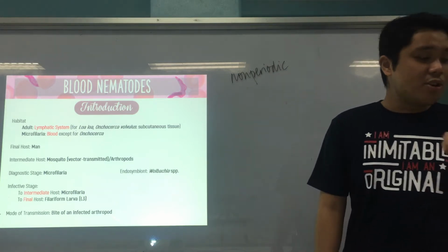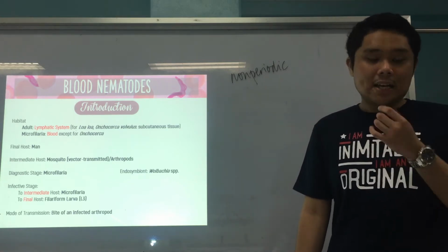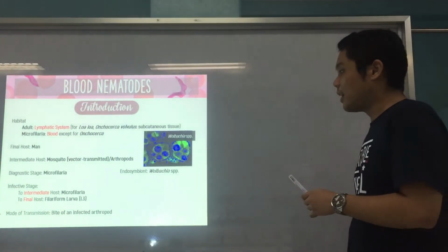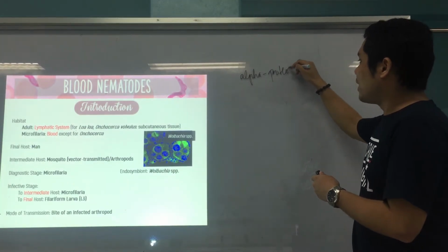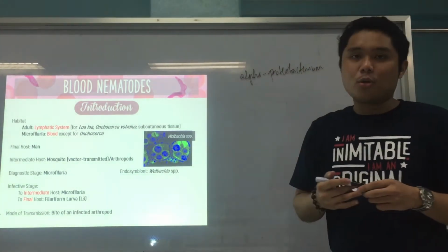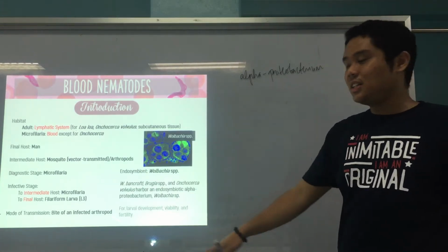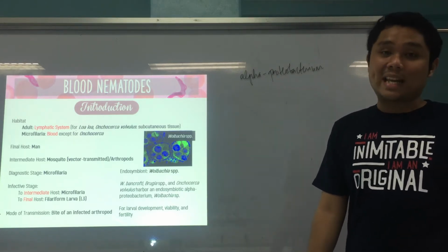And we have what we call an endosymbiote. This is a bacteria known as Wolbachia species. It's an alpha proteobacterium, a rather small bacterium. This bacterium resides in the filarial worms or in their surroundings, because Wolbachia species promote development of the larva, viability, and also fertility.